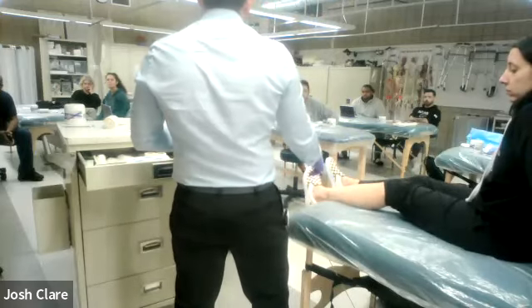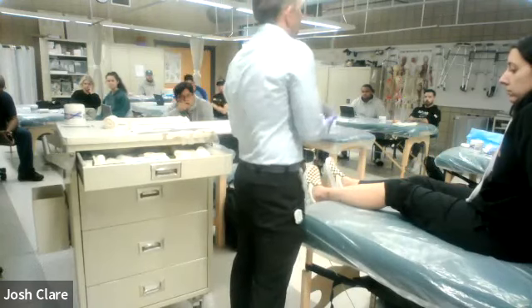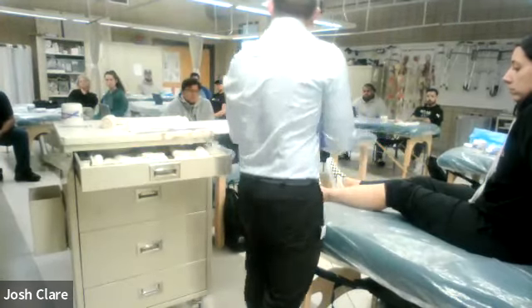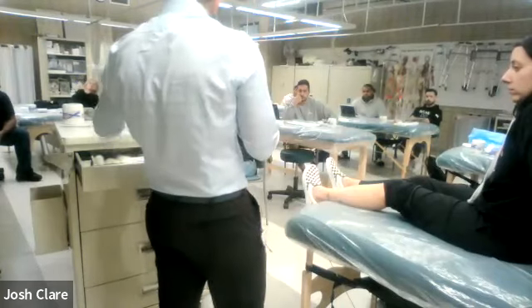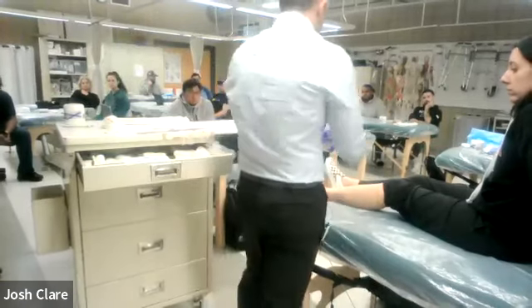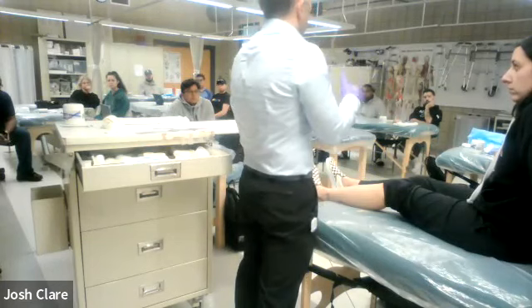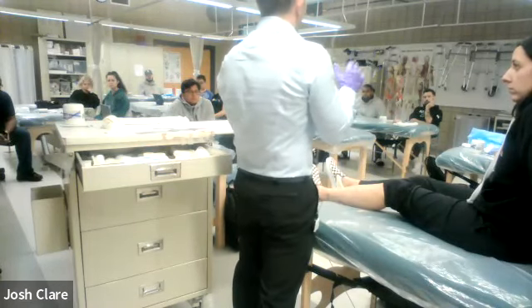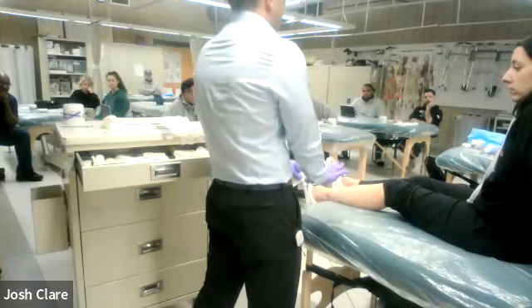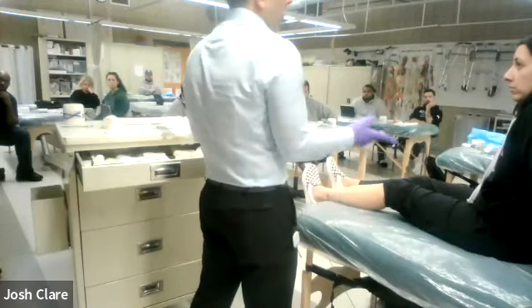Most times with a patient we would cut the sterile wrap off, away from the wound. So her wound is on the lateral, posterior-lateral of the leg — I want my scissors immediately away from the wound. Based on our chart review, talking with the patient, or personal history we would know where the wound is, so I would cut away from it. For our purposes we're going to be unrolling and re-wrapping since we want to reuse them. There's going to be gauze over the wound — I'll take that gauze off and make sure everything's disposed of.